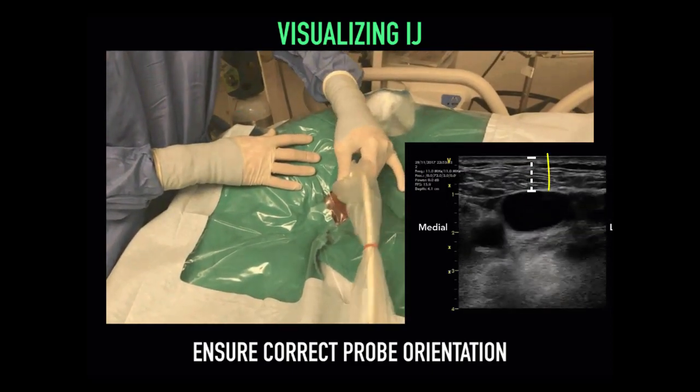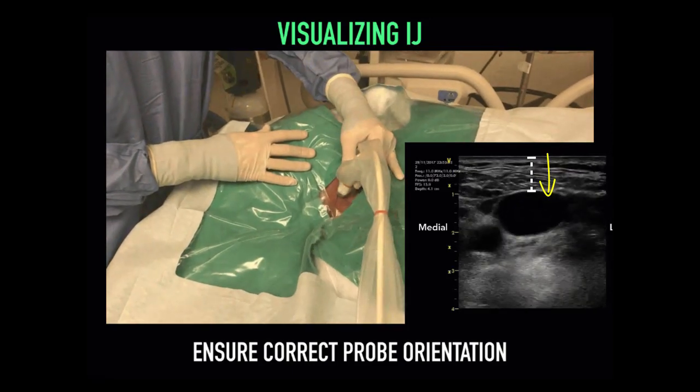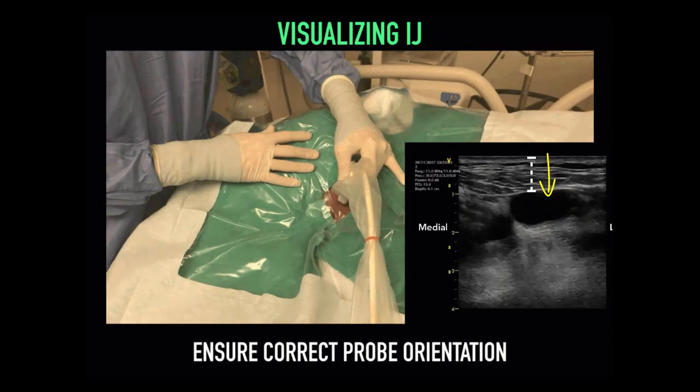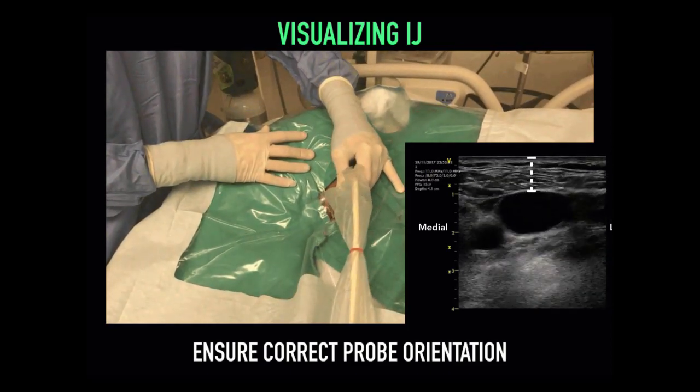In this case, we can see it's 1 centimeter from skin to penetration of the vein. And this helps to understand how deep that needle really should be going when you're cannulating the vessel.